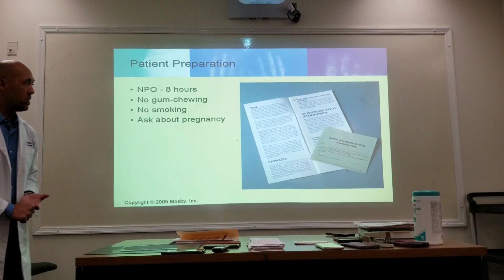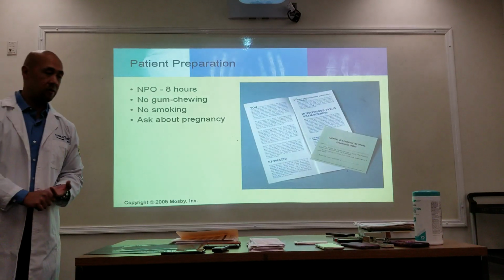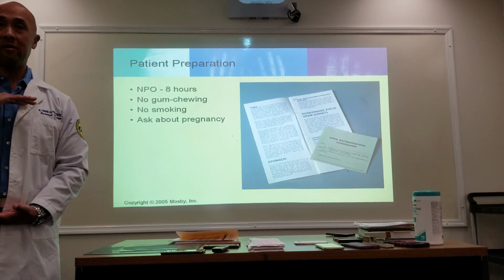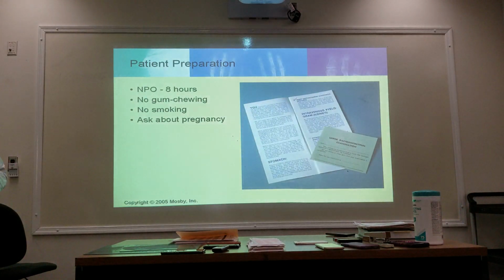Okay? How do we get them dressed for a small bowel? Just have a gown on and that's it. Again, we're looking at this area over here, so just remove everything from the waist up. Okay? Yeah, that's about it. They can leave their underwear on.